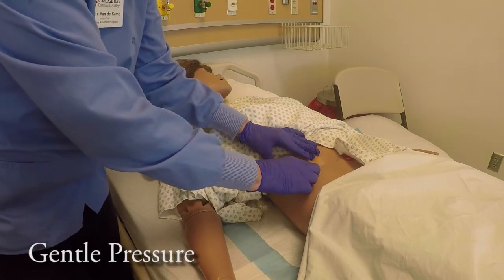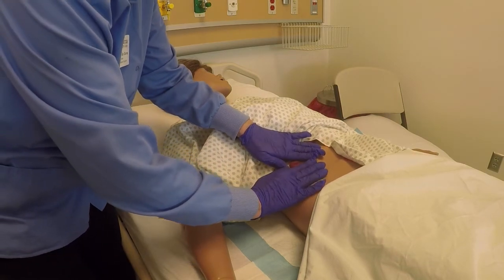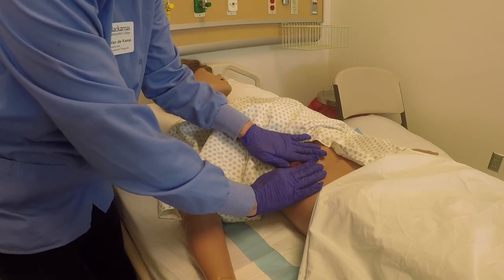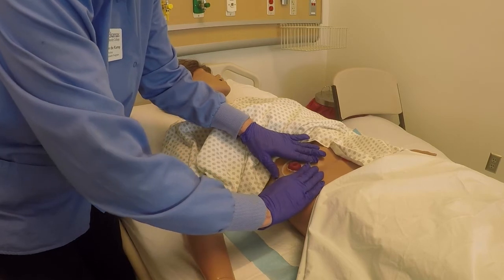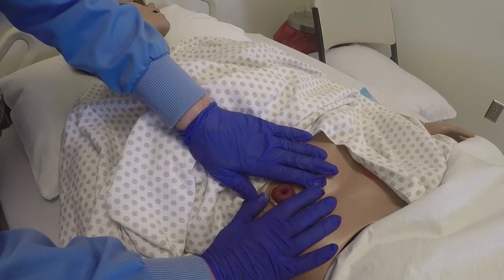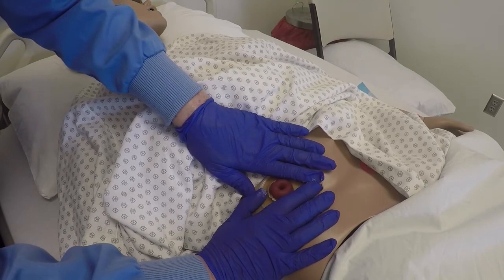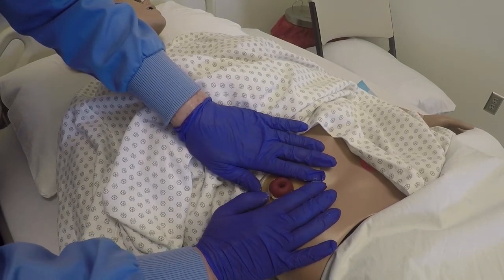G is for gentle pressure. I'm going to press around the skin barrier so that it seals to the skin. I'm going to start from the bottom and work up toward the top, applying gentle pressure from my fingers and holding this pressure for one to two minutes to get a nice tight seal. That way, liquid from the stoma will not irritate the surrounding skin.